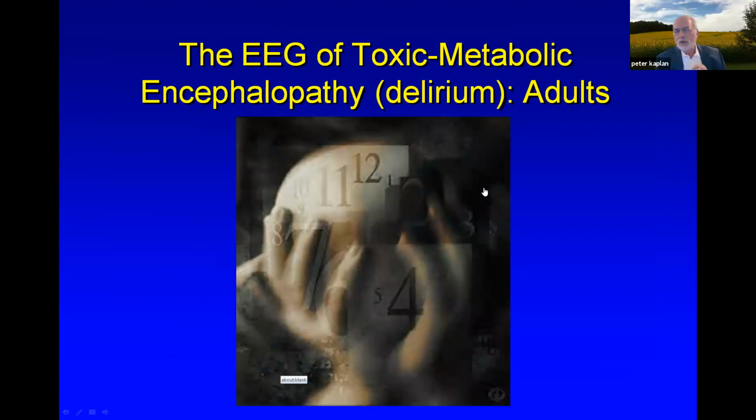Well, I agree. It's all a bit bewildering, and EEG is not the sexiest of aspects of neurology, but as you can see, it can be helpful in the global management of patients with altered mental status. Typically, some of the people who are just coming to neurology, when they see someone with altered mental status, will order a head CT scan.